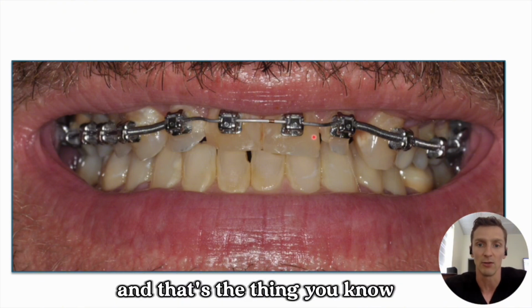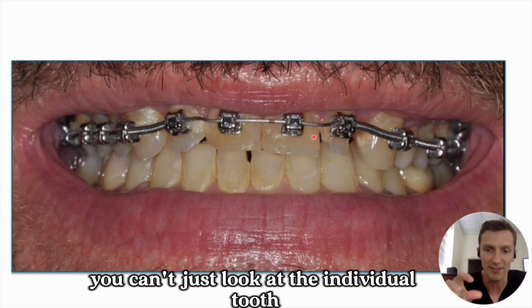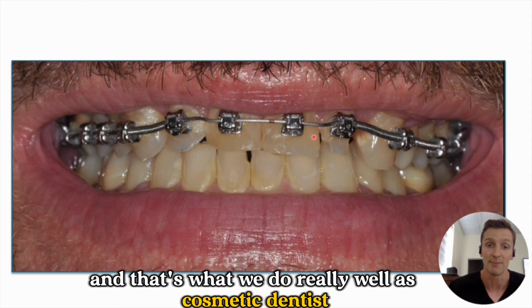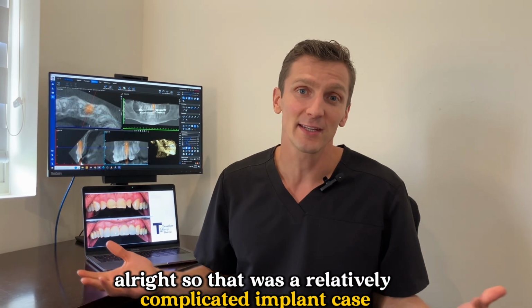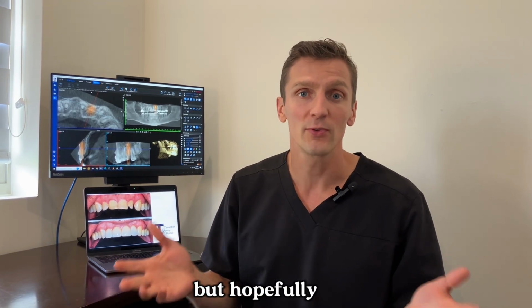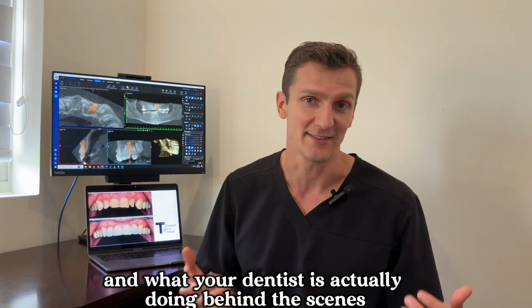And that's the thing, with a dental implant or with any type of restoration, you can't just look at the individual tooth. You got to look at the smile and the bite as a complete system. And that's what we do really well as cosmetic dentists and as dentists who have an education on occlusion and bite force management. All right, so that was a relatively complicated implant case, and I could have gone into a lot more detail, but hopefully that gives you a better idea of what the process looks like and what your dentist is actually doing behind the scenes.